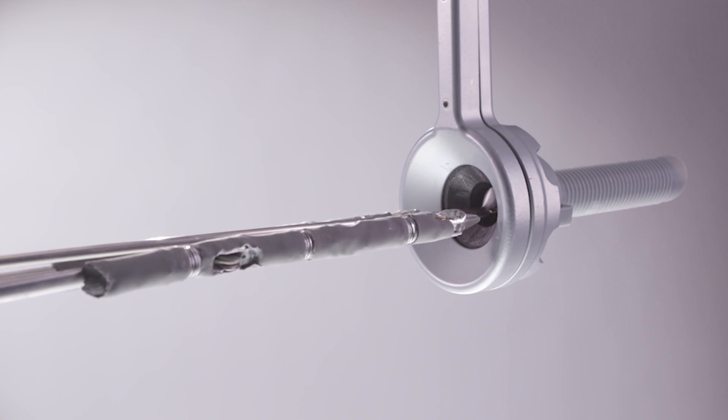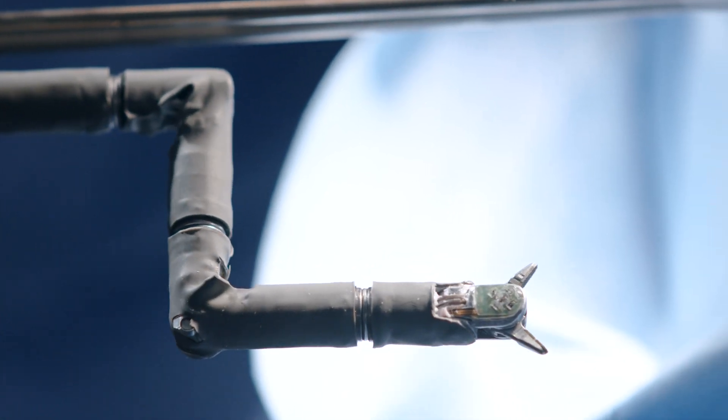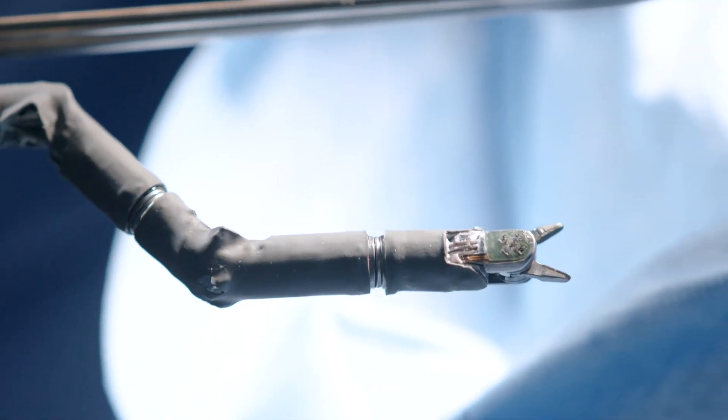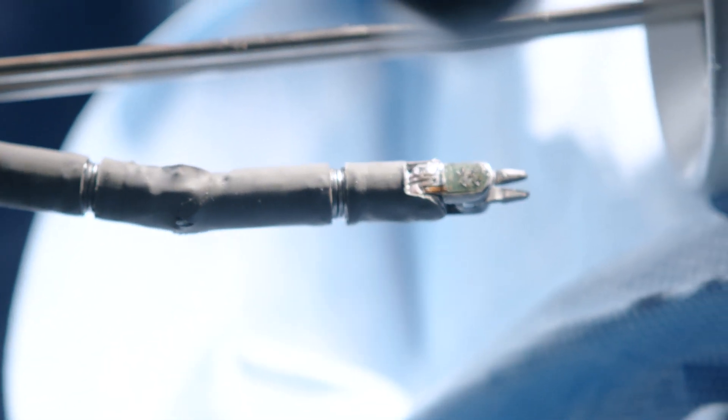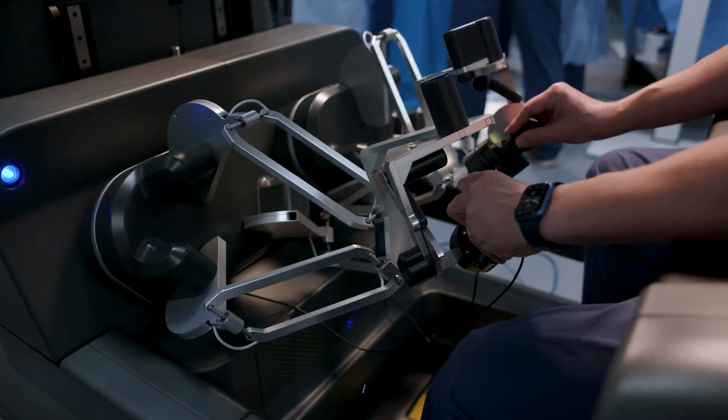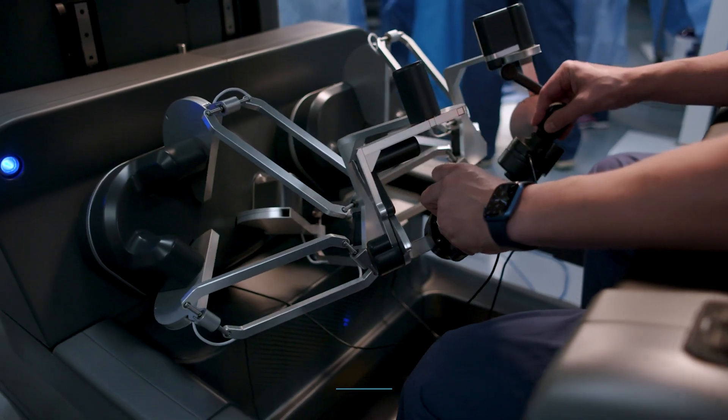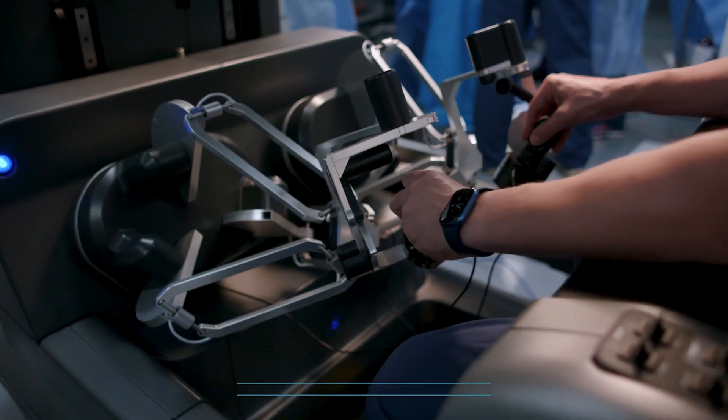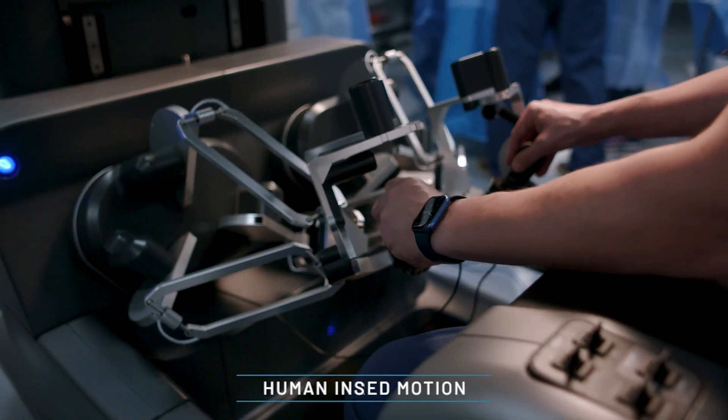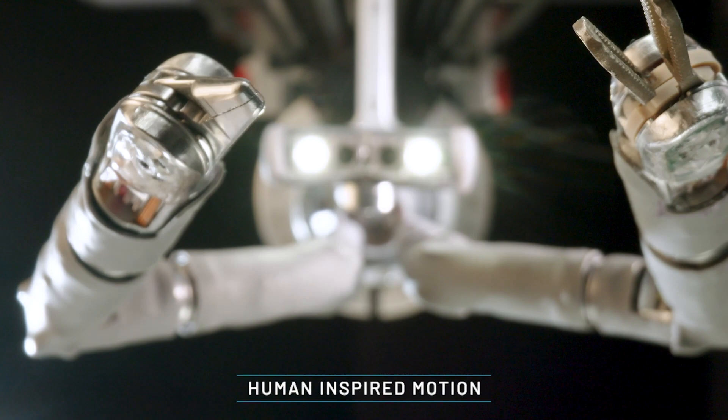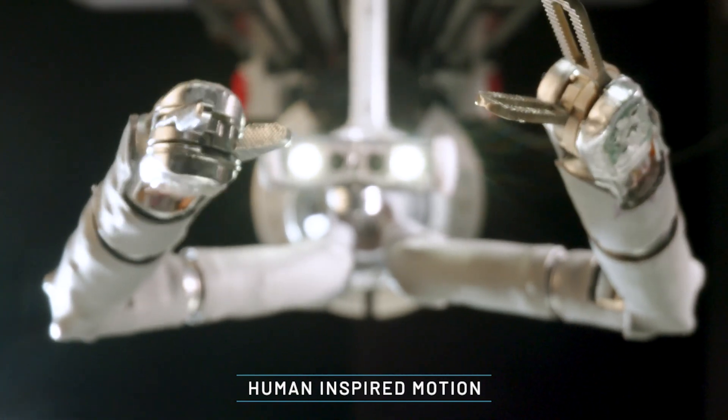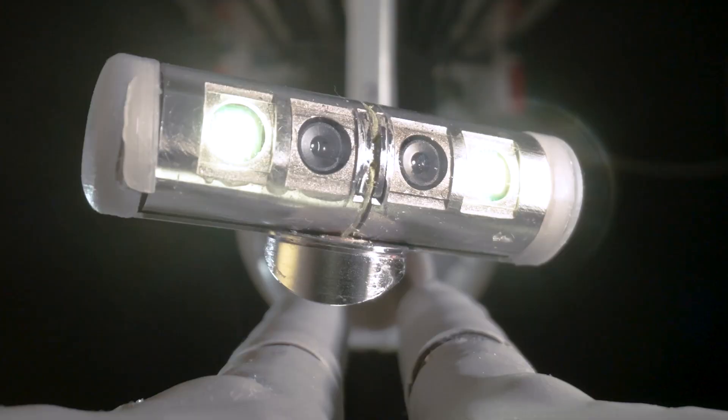Not only are we able to put wrists inside the abdomen, but also elbows and shoulders that replicate a surgeon's natural movement and create unprecedented dexterity and range of motion.